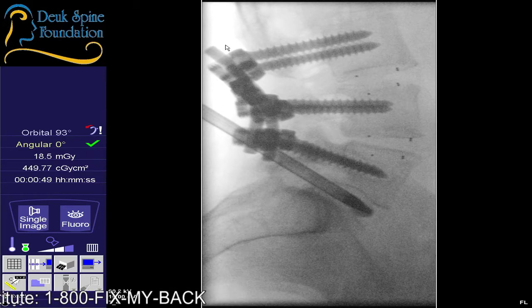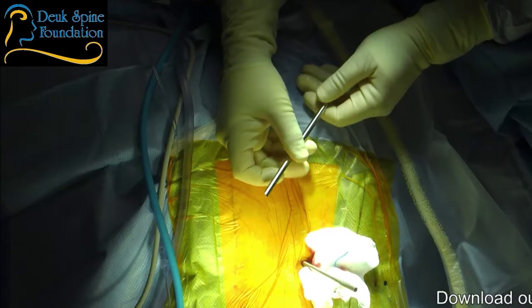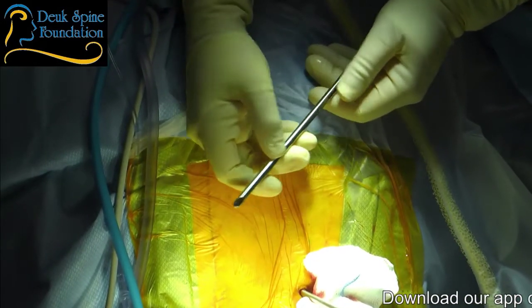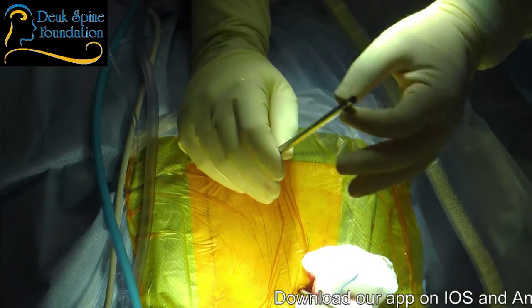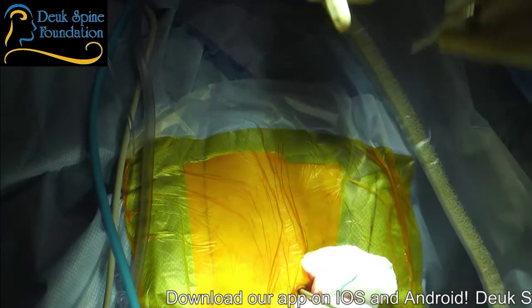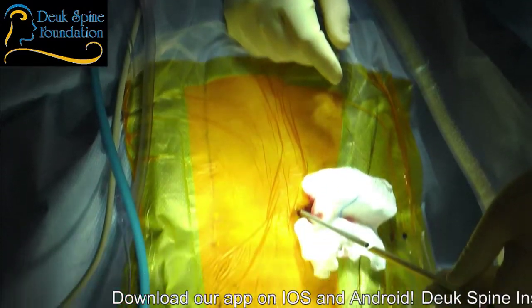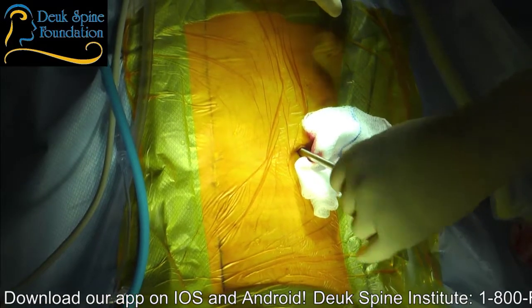So now that we have our dilator in, I'm going to put our tube. So for those of you wondering, how do you do this surgery? Can you zoom in there, Sean, and show them this tube? This is my McDonald's, metal McDonald's shake straw. The whole surgery is done through this 7 millimeter wide tube. That's why it's a 7 millimeter incision. Of course, we put the endoscope down there and we can actually see what we're doing. We're going to show you that view in just a minute.